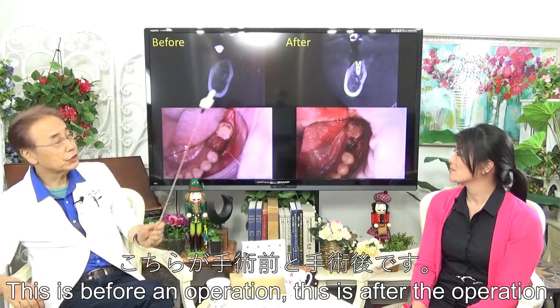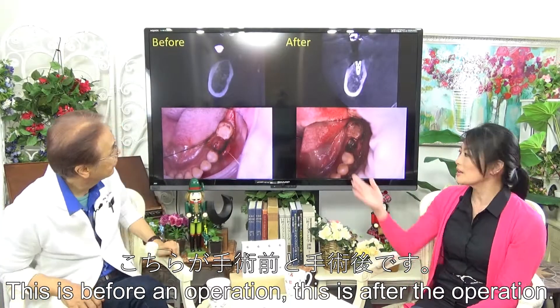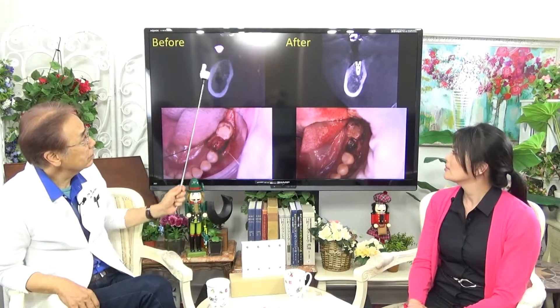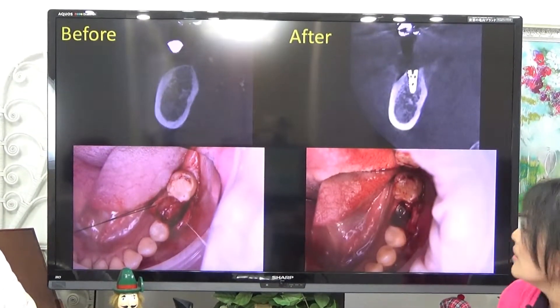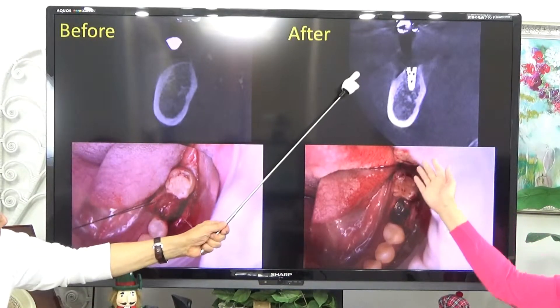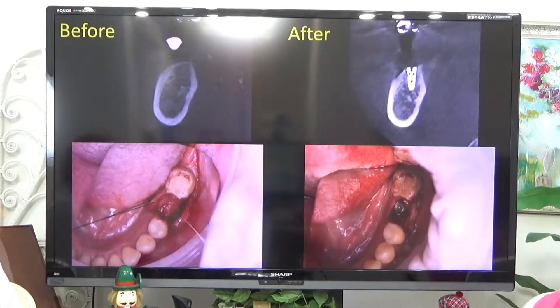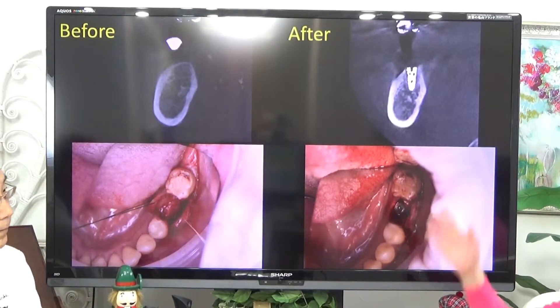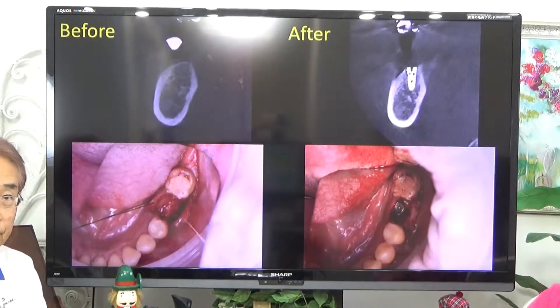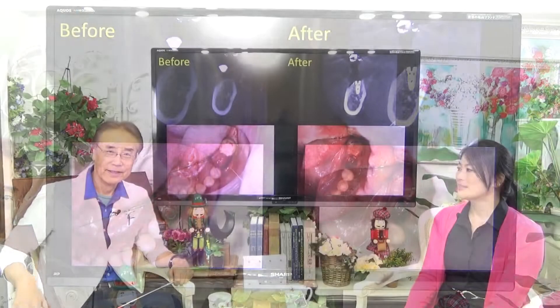This is before the operation, and this is after the operation. You can see the height of the bone is higher than before. This was achieved without bone grafting and with only one operation. You can also see that the alveolar bone appears whiter than before, which means it has become harder than before.